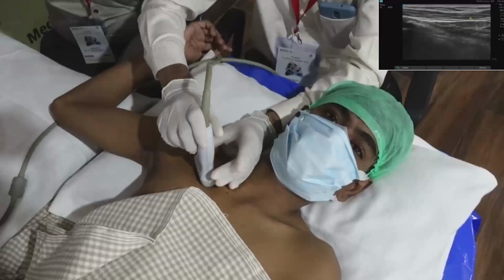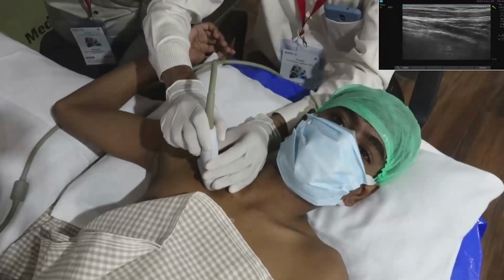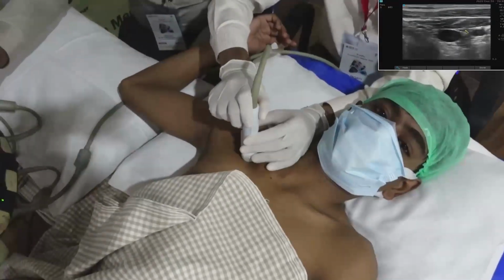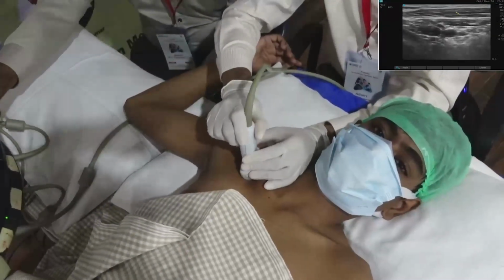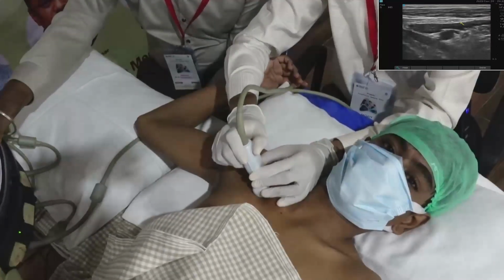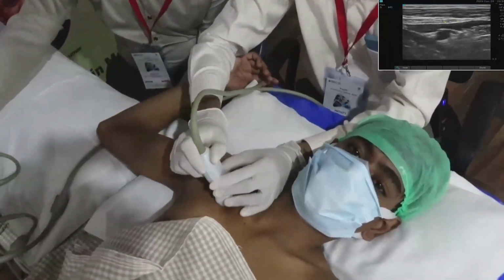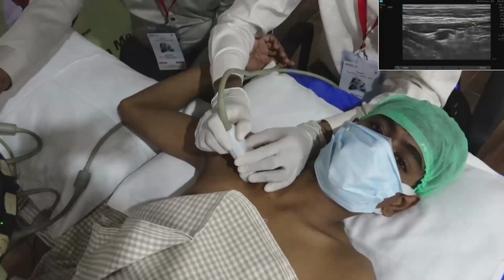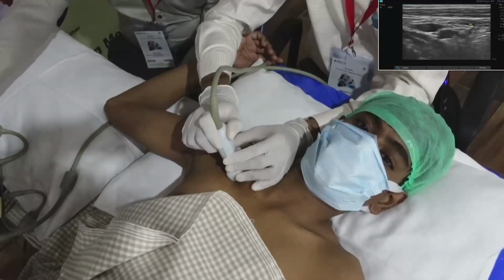The muscle first seen is pectoralis major. Then we look for one important muscle, that is subclavius. Before going into subclavius, we see the axillary vein getting drained by another vein, that is the cephalic vein.